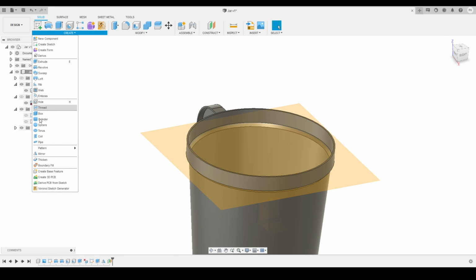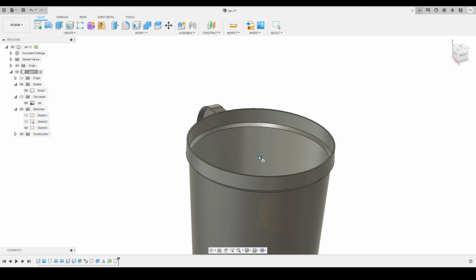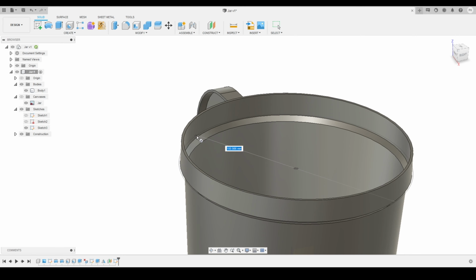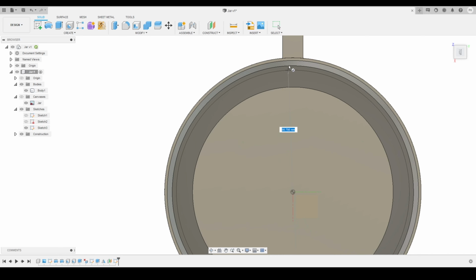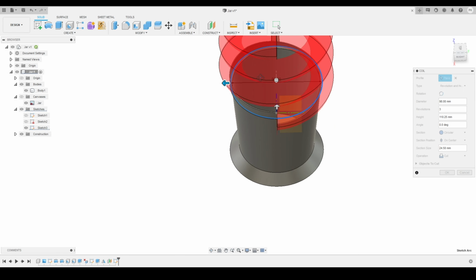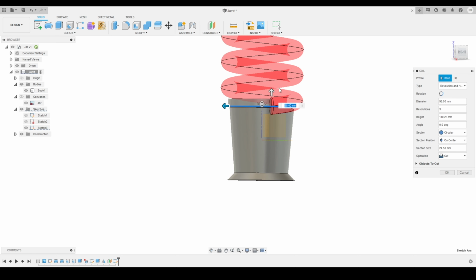Now we'll go into the create panel, activate the coil tool from here, and click on the plane on which I want to create a coil. I will select the origin and now we'll specify the diameter of this coil. I will go to the top view so I am able to see better, and now I will specify the diameter as this much. Here you can see I'm getting the preview of the coil. It is not good right now because we need to adjust a few more settings over here.